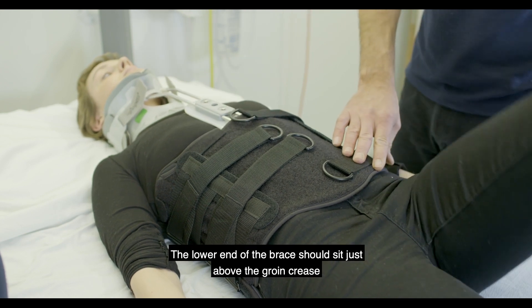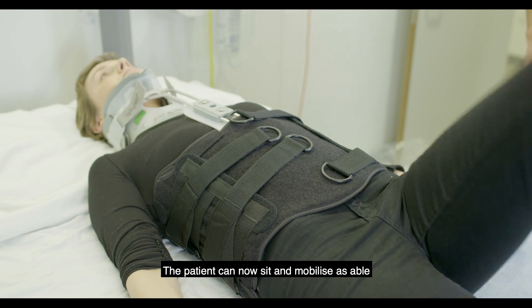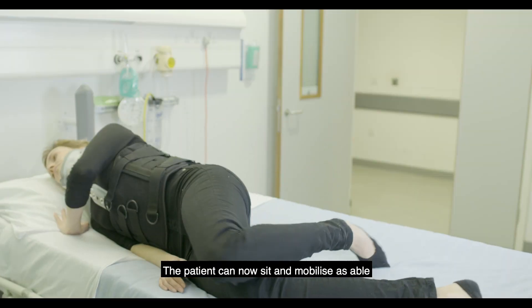The lower end of the brace should sit just above the groin crease. The patient can now sit and mobilise as able.